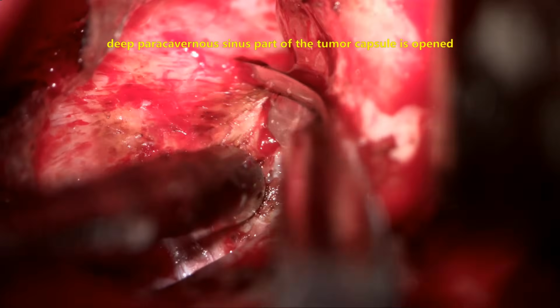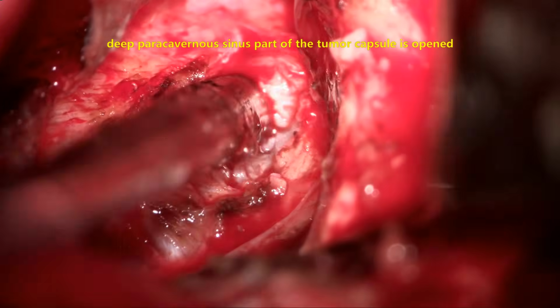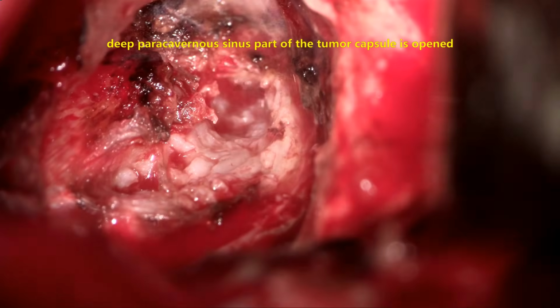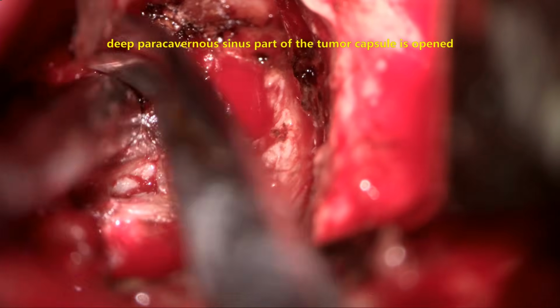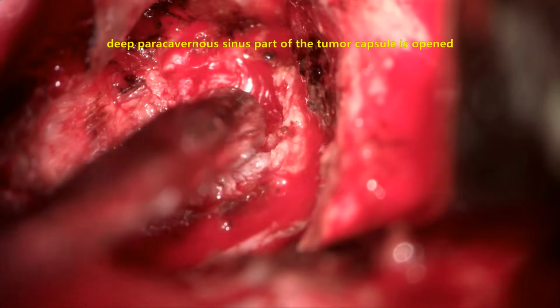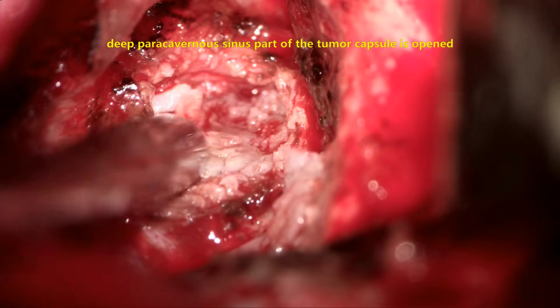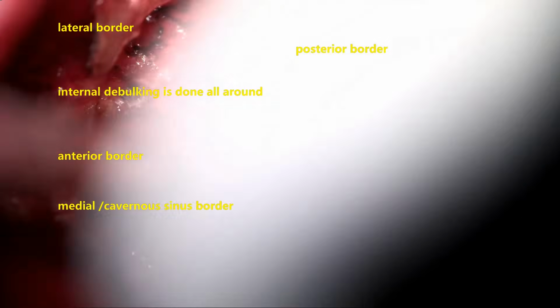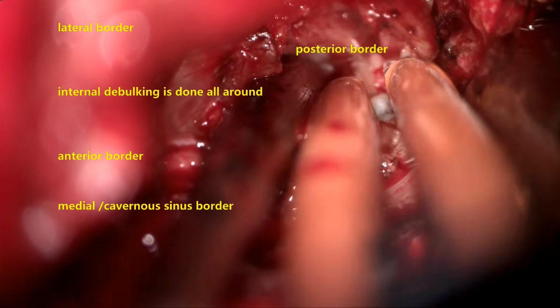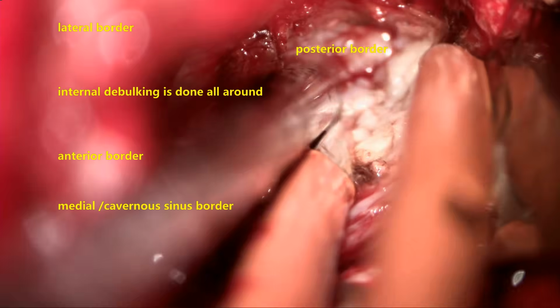That needs to be coagulated extensively. That helps in reducing the vascularity and keeping the area clean. This blood vessel comes from the middle meningeal artery branches. They are coagulated extensively, the capsule is opened, and you can see the tumor exposed from posterior to anterior. Posteriorly, it goes up to the anterior border of the petrous temporal bone. Anteriorly, it comes up to the anterior wall of the cavernous sinus, superiorly up to the tentorial edge, and inferiorly to the middle cranial fossa floor.